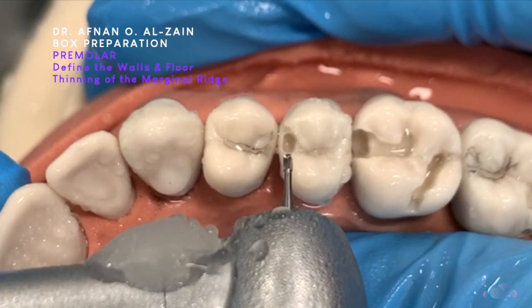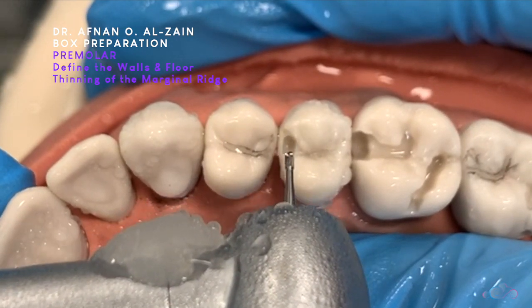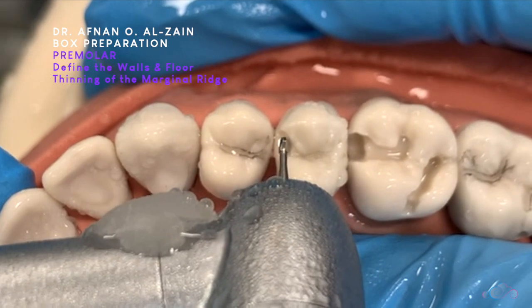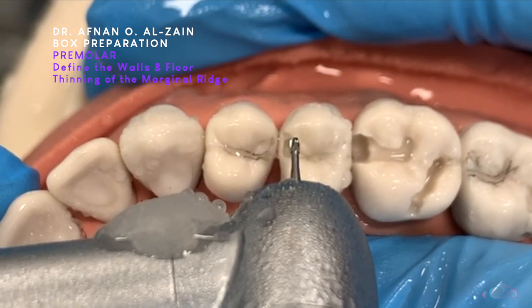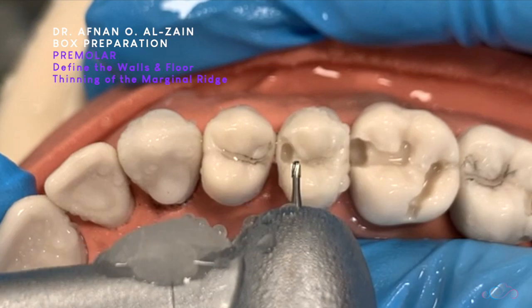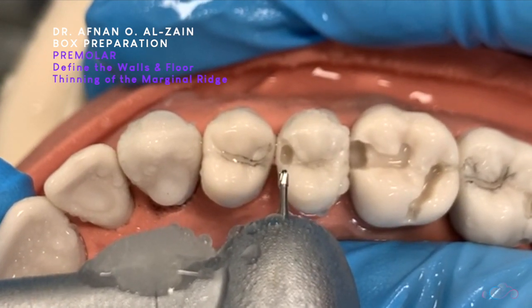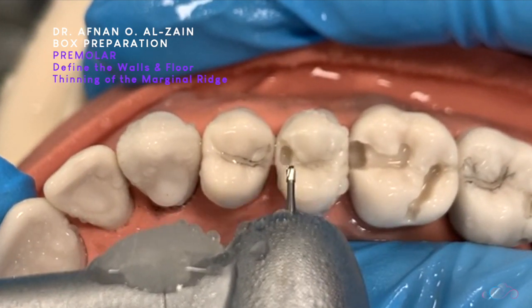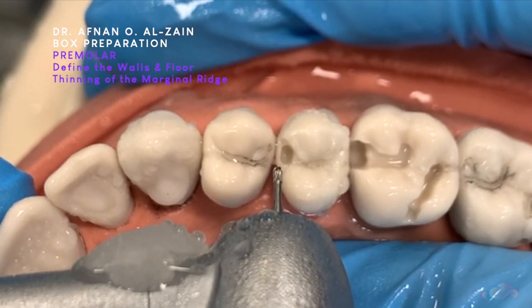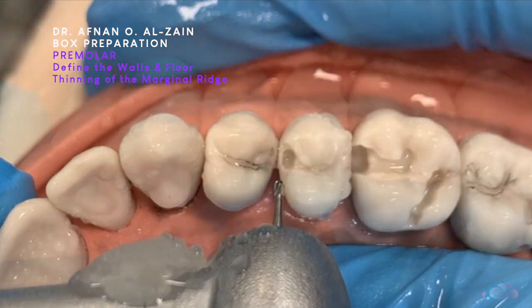And now we are just going to define the box for the angle, moving from the proximal area. We are going to define the box and thin the marginal ridge as much as possible, then break it later.